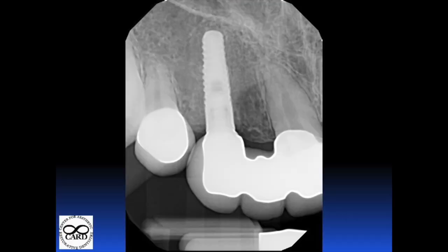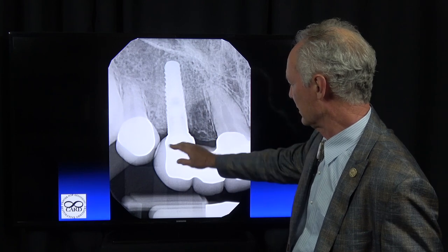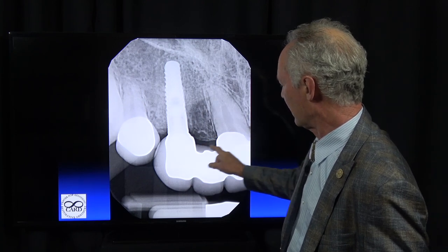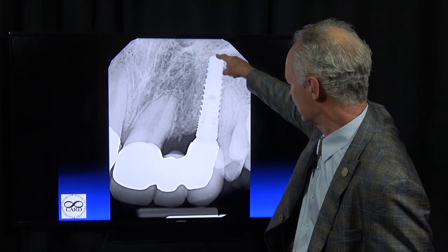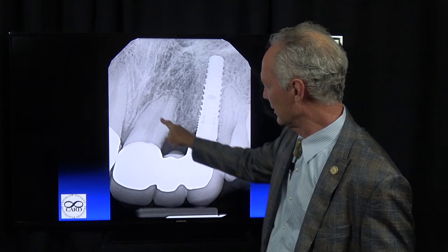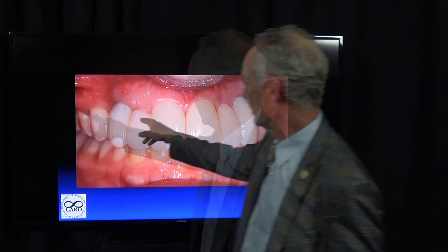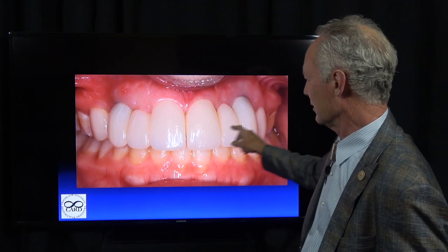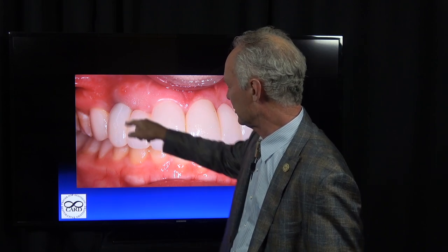After the orthodontic treatment I placed an implant here as an abutment, then connected the bridge from the implant to the right central incisor. On the other side I placed an implant here and used that implant as an abutment and connected a bridge from the implant to the left central incisor. Now you can see the gum lines are not symmetrical — this one is longer or higher than this one. That's one of the problems with an implant in the aesthetic zone. It's very difficult to control the gum line, and it's also tricky to control the papilla — the gum in between the teeth. Many times that will go away.